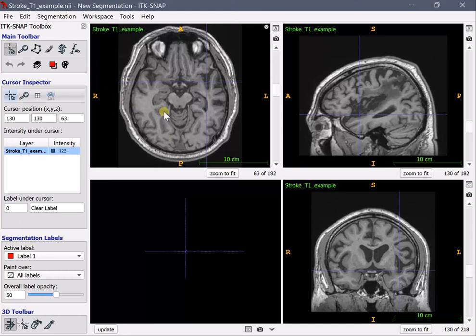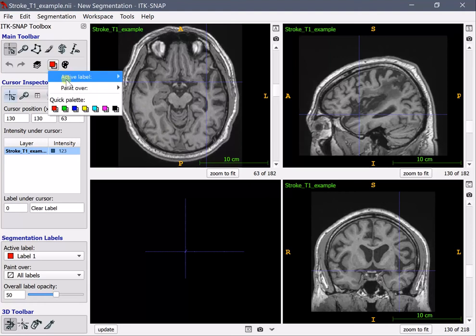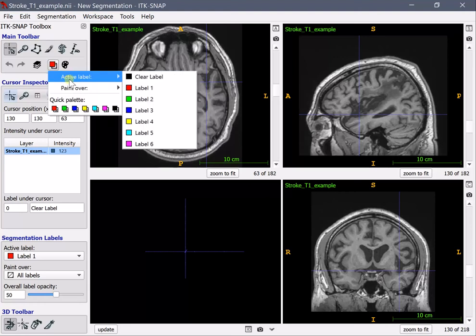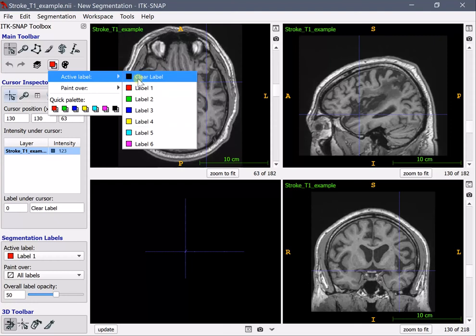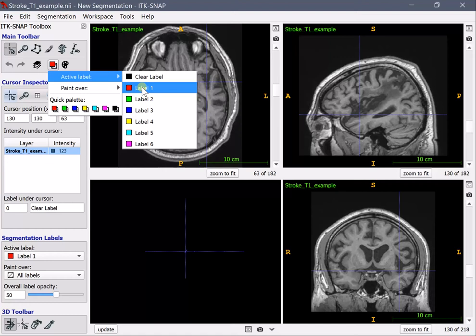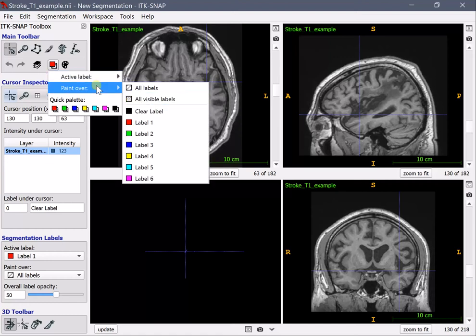The way to do that is by choosing the active label, the foreground or active label. The labels have names here and you can simply select label 1 which comes by default. This means that the voxel values where you draw will take the value 1 and that's what we need for a segmentation.